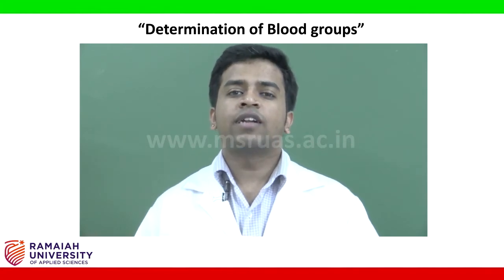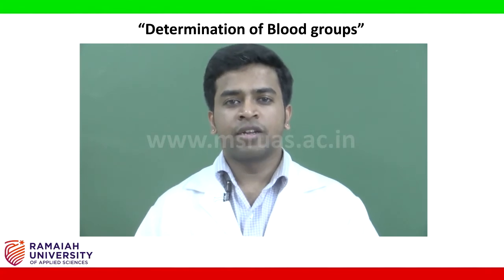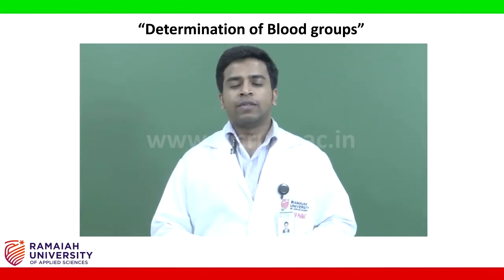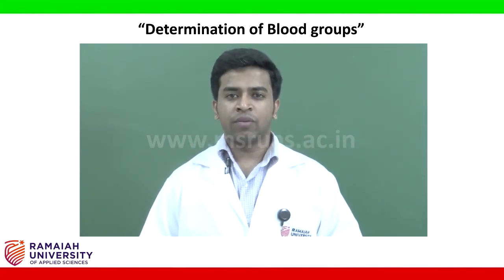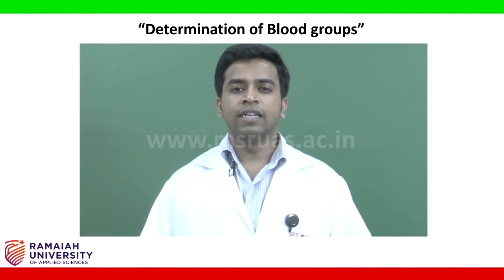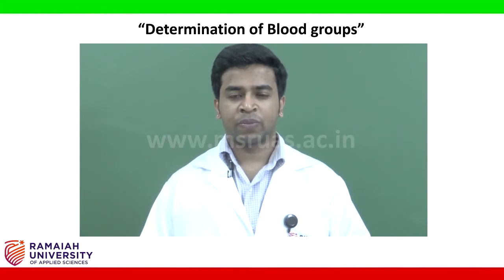Hence, the blood transfusion plays a very essential role in retaining the normal physiology as well as in the saving of the life of a person. However, the blood can be only given after performing the blood grouping experiment, which is an essential requirement to avoid mismatching before the blood is given to any individual. Blood grouping is also done to settle paternity disputes and other medico-legal purposes.